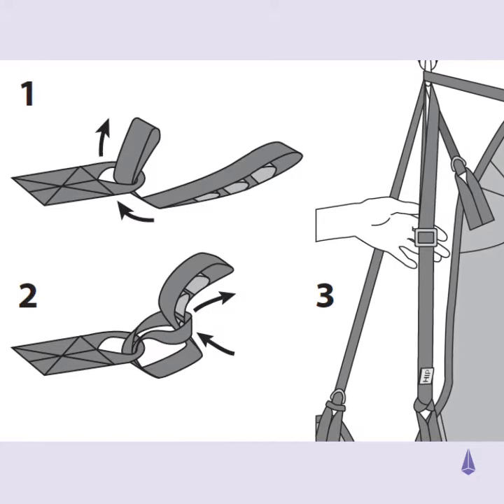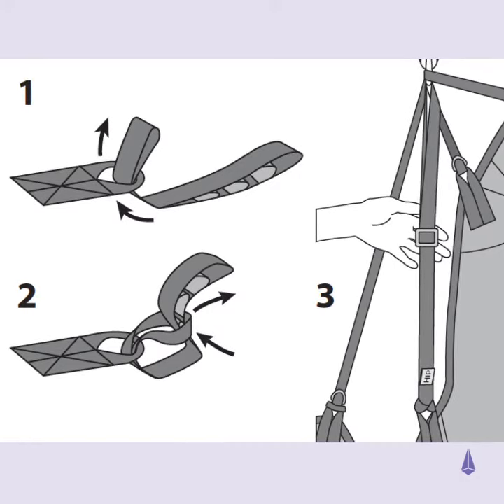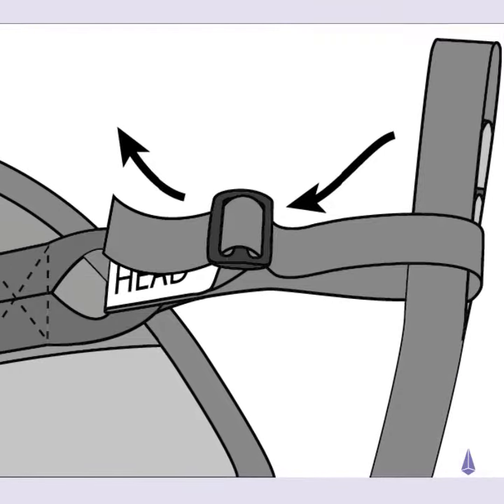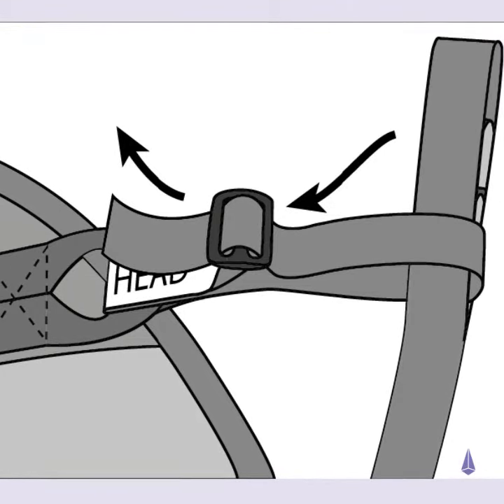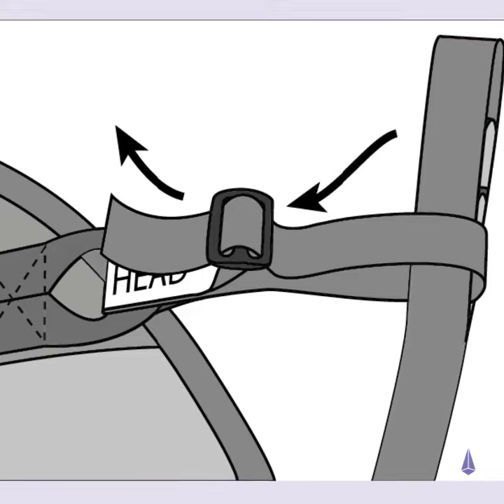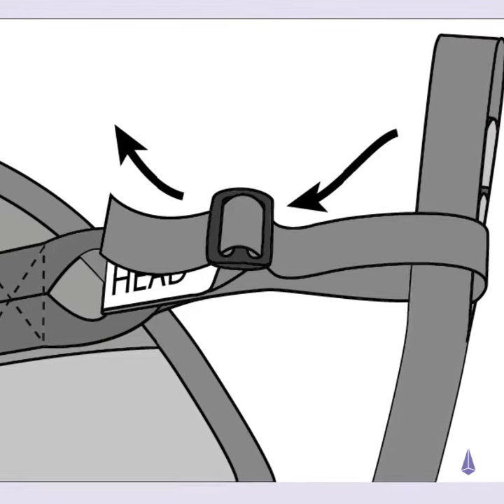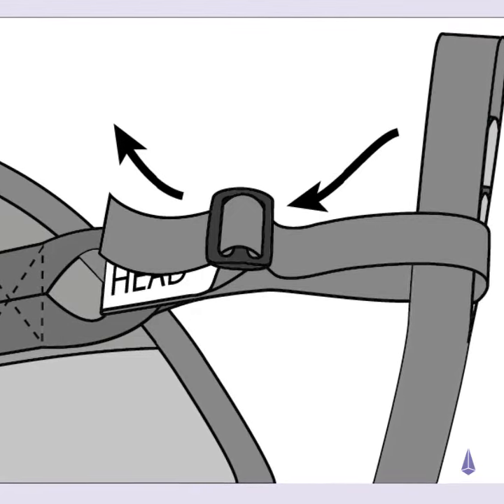The hip tape should pick up the pelvic area and the legs simultaneously. If the sling is supplied with head support tapes, feed them through the shoulder tapes and back through the slider, adjusting to the required position.